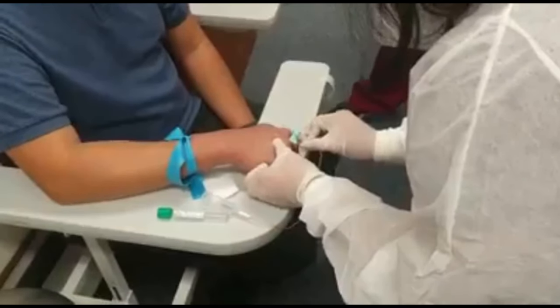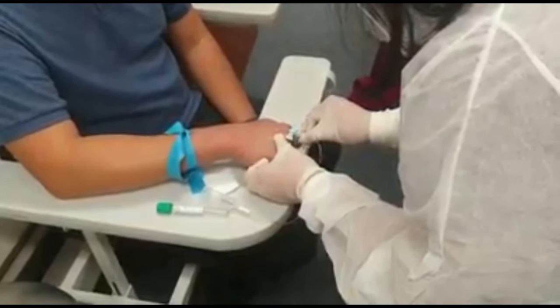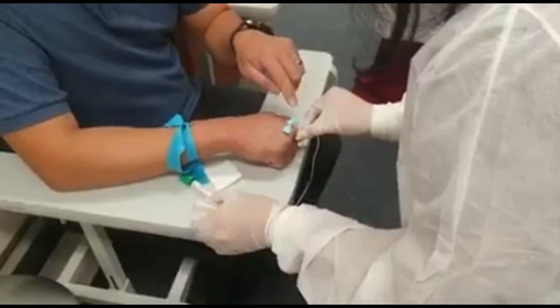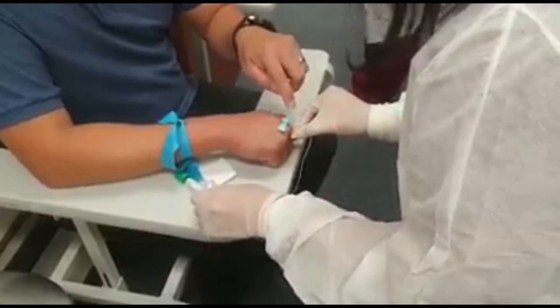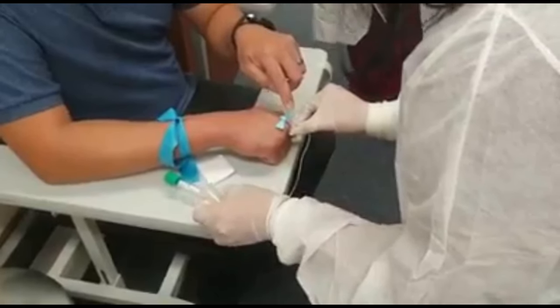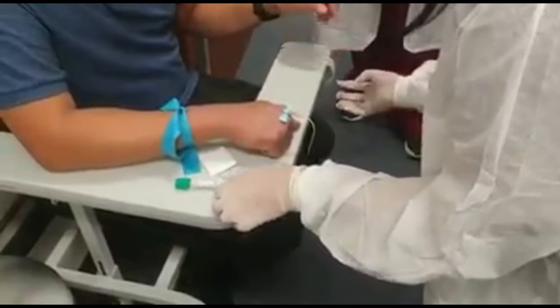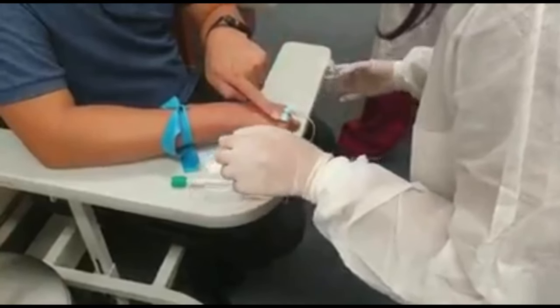No, take it down. Nice. Okay, so you know that you stuck the vein because there's a flash. So at this point, what you can do is you can let go. And then remember that tape I said earlier. So you can get the tape and then just put it slightly here on the corner.